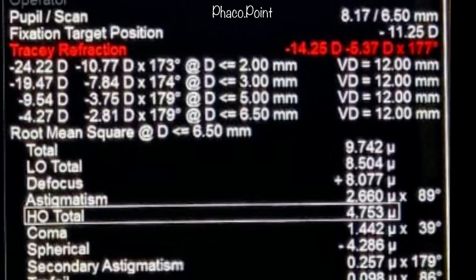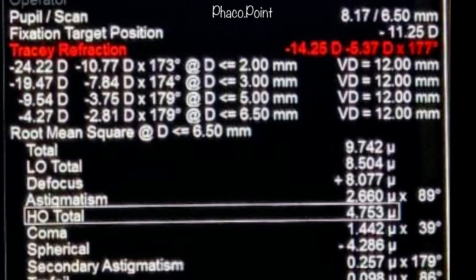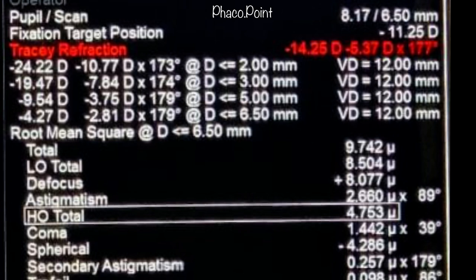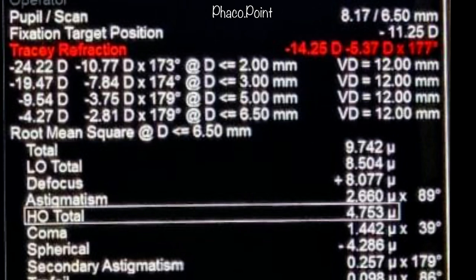When we look at the change in refraction with respect to pupil size: at a 2 mm pupil, there is a myopia of minus 24.22 diopters with a cylinder of minus 10.7 at 173 degrees. At 3 mm this goes down to minus 19 diopters with a reduction in cylinder to minus 7.84 at the same axis. At 5 mm, myopia reduces further to minus 9.54 diopters with a further reduction in cylinder, and at 6.5 mm pupil size, there is just a myopia of minus 4.27 diopters with a cylinder of only minus 2.81 diopters at 179 degrees.